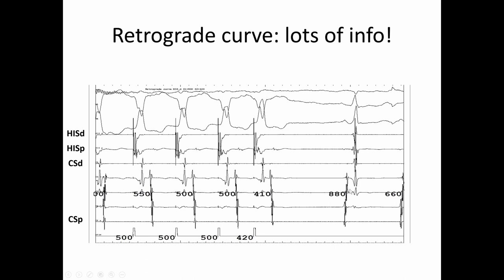When you stop pacing, you've got sinus rhythm and you can see that there's pre-excitation. So you've seen this one slide and gone, okay, this person's got a left lateral accessory pathway that's non-decremental. And so even with the first maneuver, you're already thinking about what the likely diagnosis is.